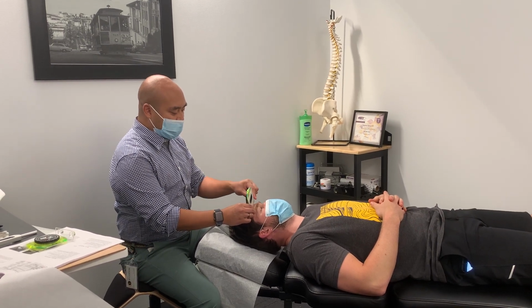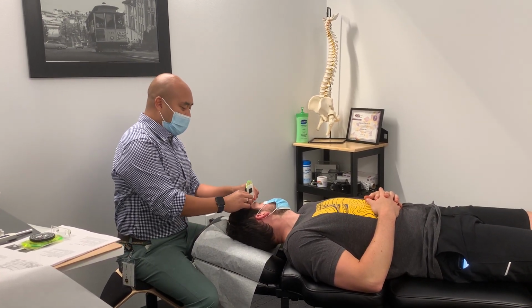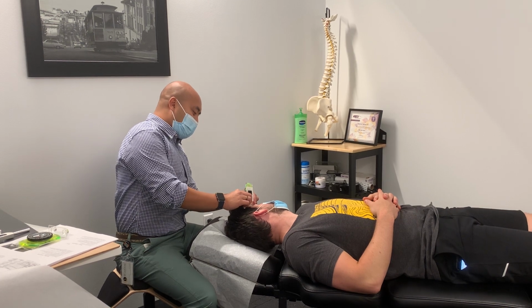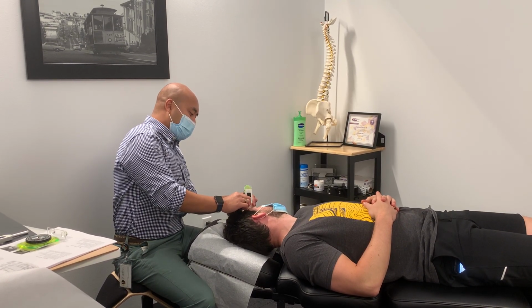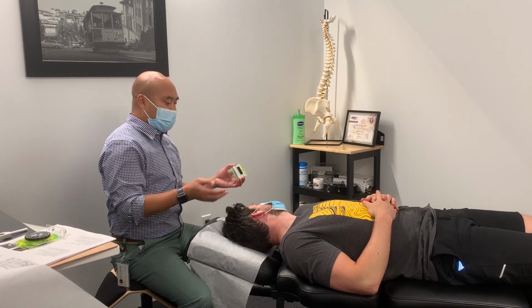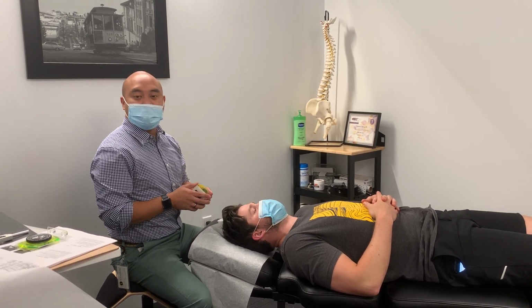He'll rotate to the left, looking over his left shoulder. I'll follow the inclinometer with him, and I'll note the range of motion for left rotation of the cervical spine. Also asking the patient if there's any pain or discomfort with doing so.